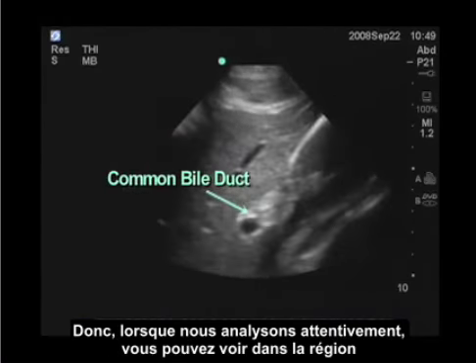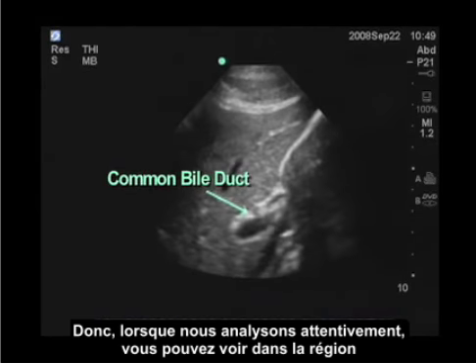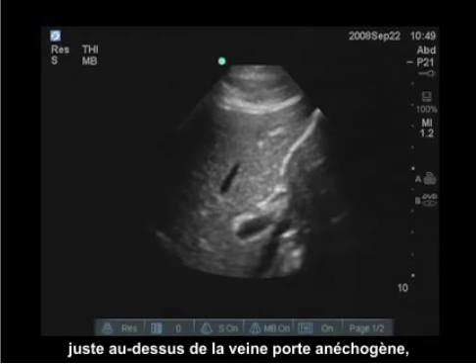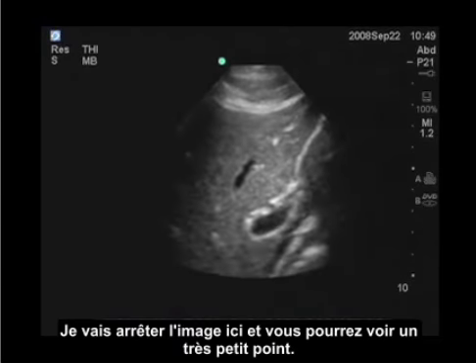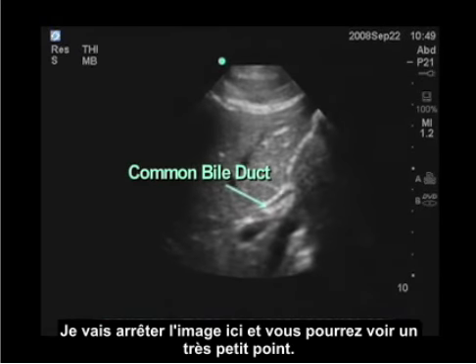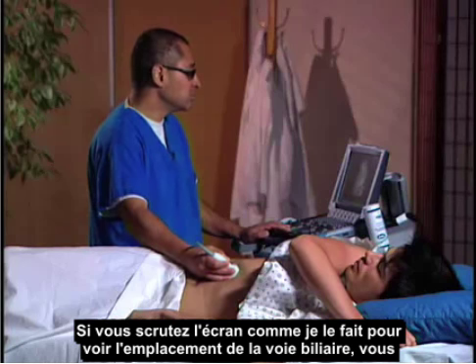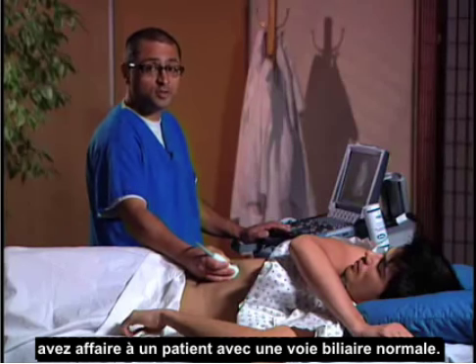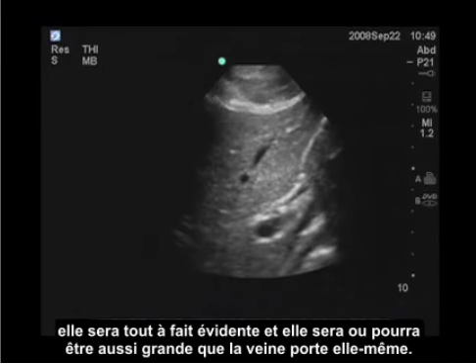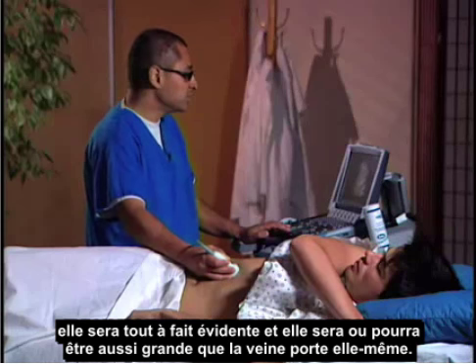When we carefully scan, you can see an area just above the portal vein which is anechoic. You should be able to see a very tiny duct. If you're squinting at the screen trying to see where the duct is, you're dealing with a patient with a normal duct. Usually when the duct is enlarged, it'll be quite evident, and it can be as large as the portal vein itself.